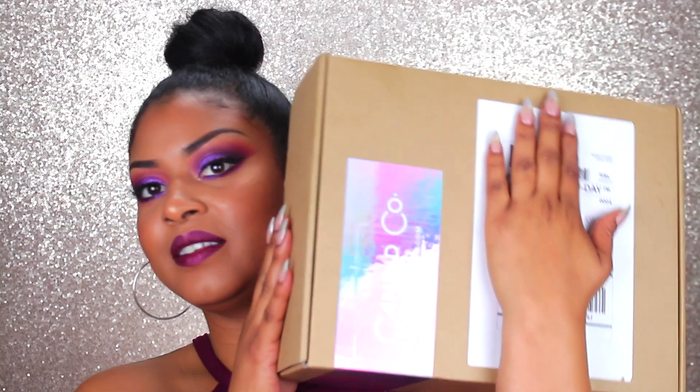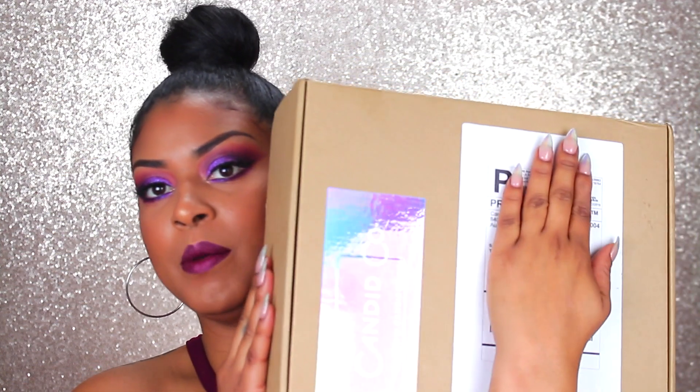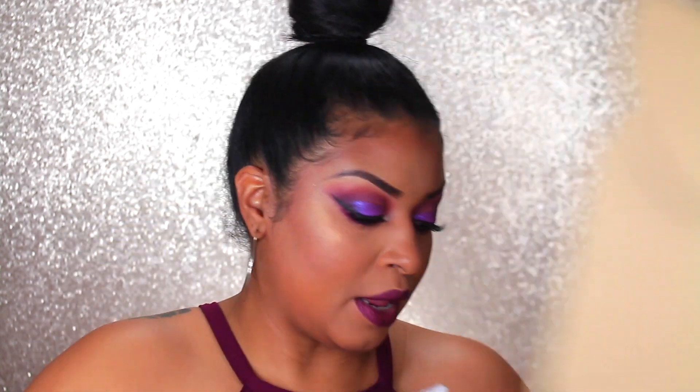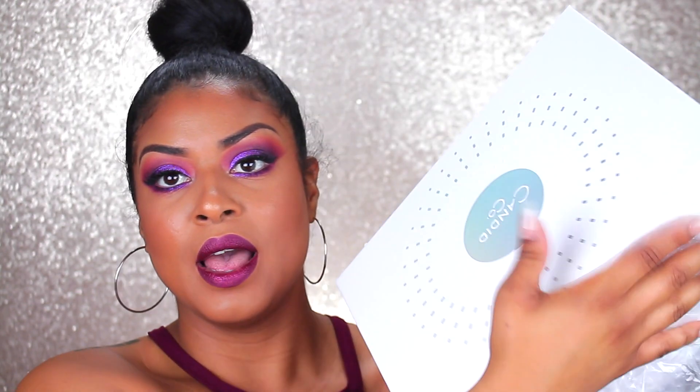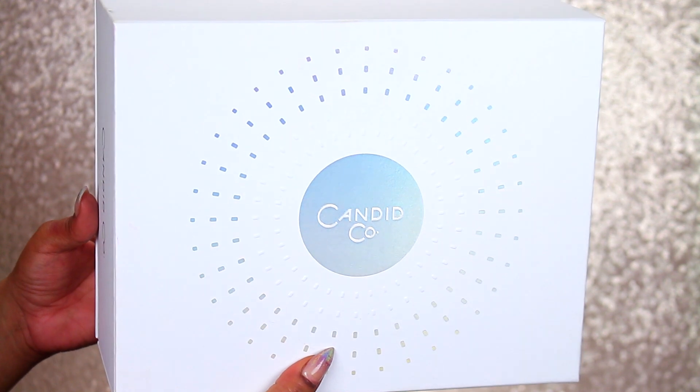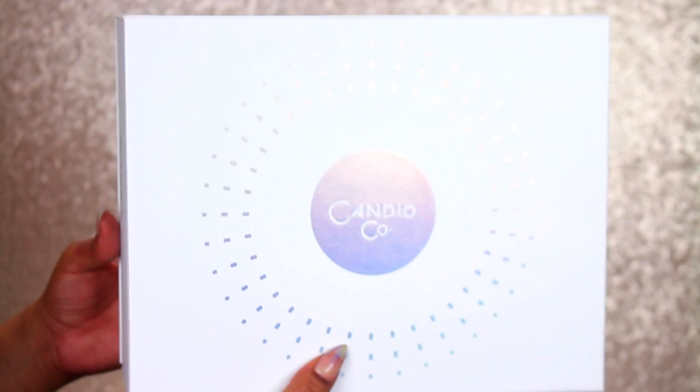So it does come in a box like this. I'm just going to go ahead and put my hand over here because it has my address on it, but it comes in this nice sturdy box. I was pretty impressed by the packaging because I was wondering how it was going to come. When you open it up, it already came in a plastic wrapping to protect the outer casing of the box.